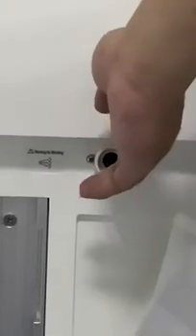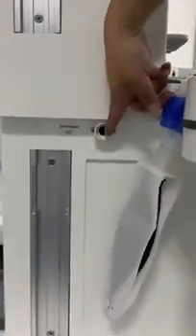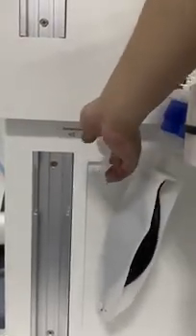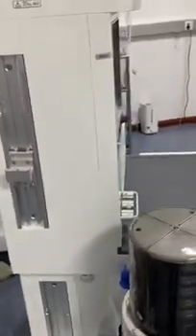And here we have a gas port. This one is for the AGSS. For example, the waste gas will come out from here. And usually we will connect it with a pipeline, and the other side we lead out through the window. So the waste gas will go out of the patient ward. But you can also choose to equip the AGSS. Then we will give a big bottle here to connect with the waste gas port. So then the waste gas will be collected and cleaned, and then there will be no pollution.